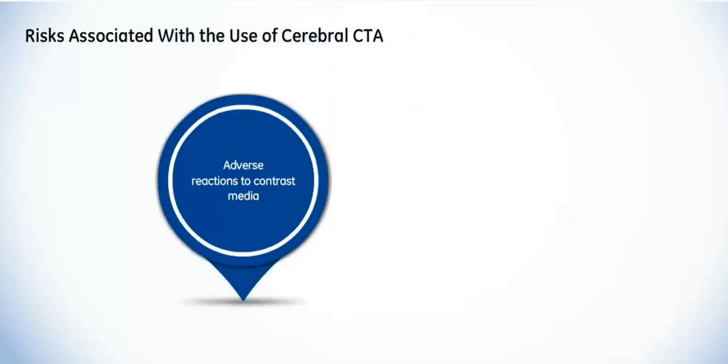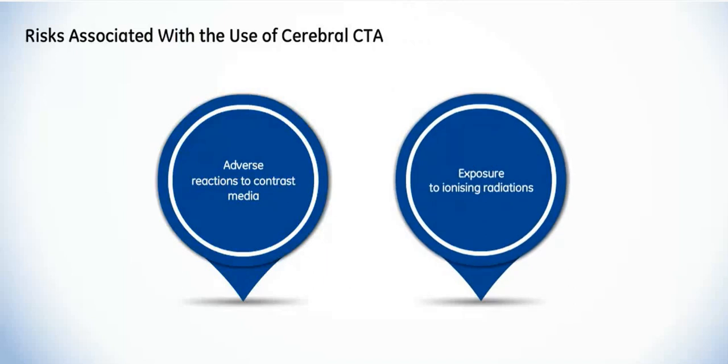The major drawback of cerebral CTA is the adverse reactions associated with the use of contrast media, which can range from simple allergic reactions to anaphylaxis to contrast-induced nephropathy. Exposure to ionizing radiations is another concern associated with the use of CTA.